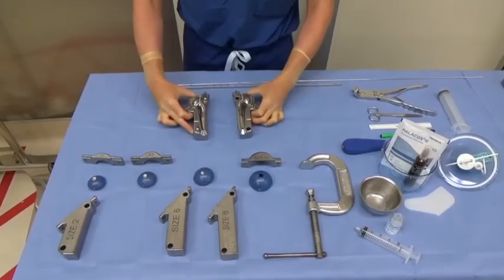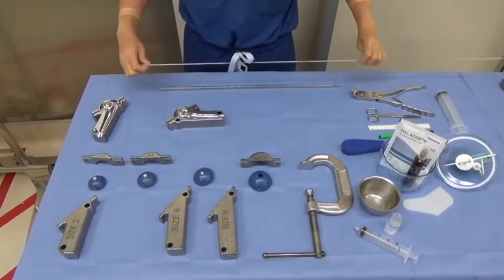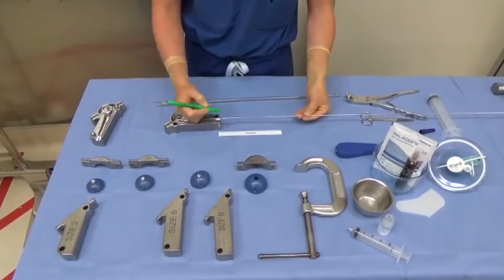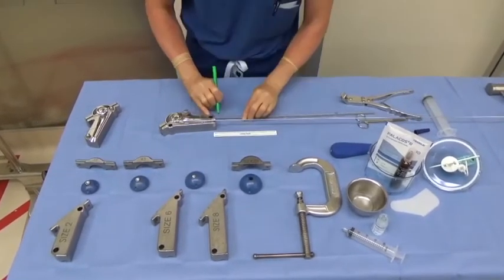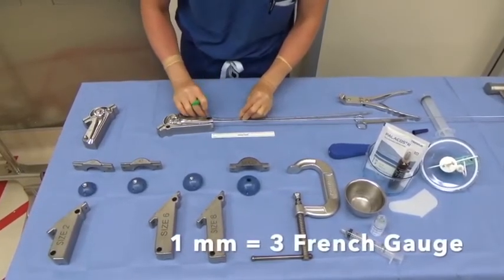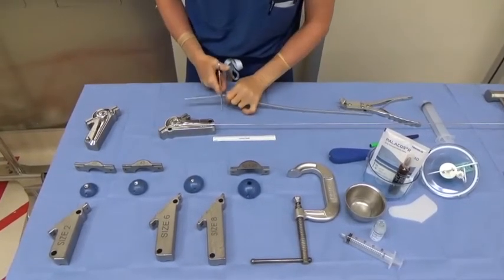Next, prepare the distal chest tube augment. The diameter and length is determined intraoperatively using the sounder typically employed for humeral canal preparation. The distal canal diameter is converted to the corresponding chest tube size using the equation 1 mm equals 3 French gauge. Here, 10 cm of a 28 French catheter are used.